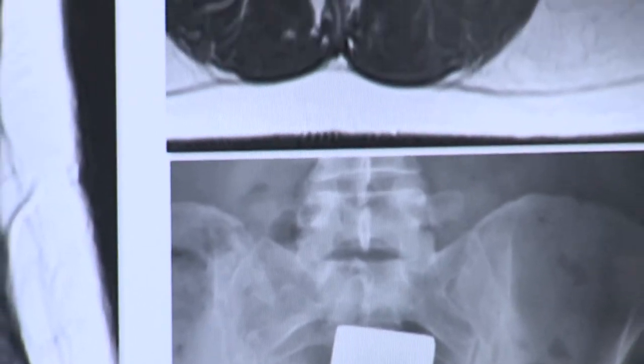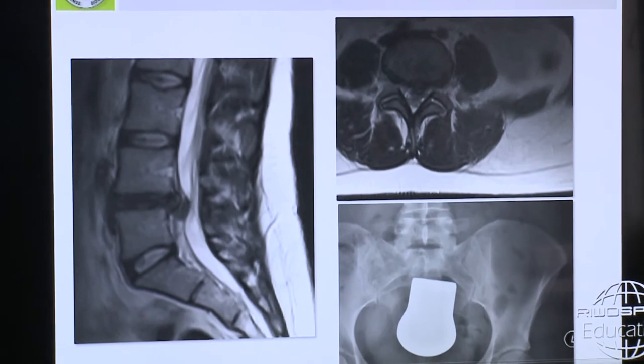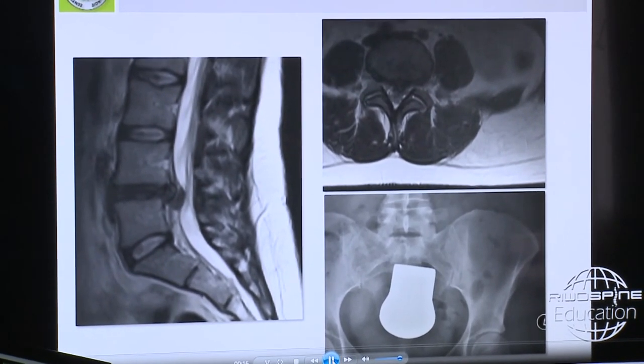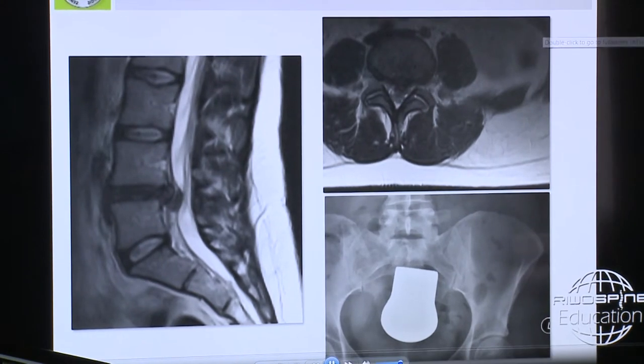Before we start with the live surgery, I will give you a short introduction of the patient. We had a young woman, 30 years, with sciatic pain since a little bit more than 3 weeks. And since 2 days, she also has weakness of the muscle of the peroneal nerve. That was the reason for her and for us to perform an operation. Because of the weakness, 3 of 5, we decided for the operation.